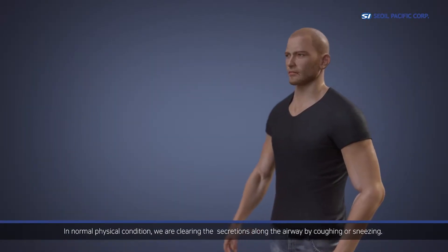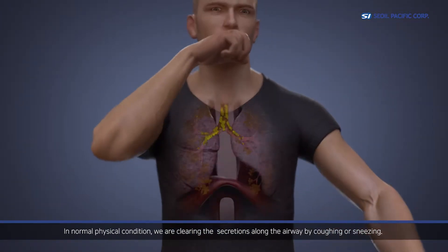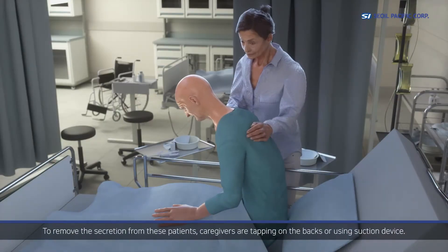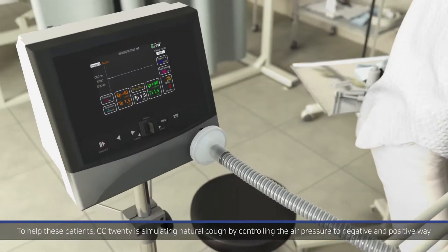In normal physical condition, we are clearing the secretions along the airway by coughing or sneezing. But some people are not able to do this due to several reasons. To remove the secretions from these patients, caregivers are tapping on the backs or using a suction device.